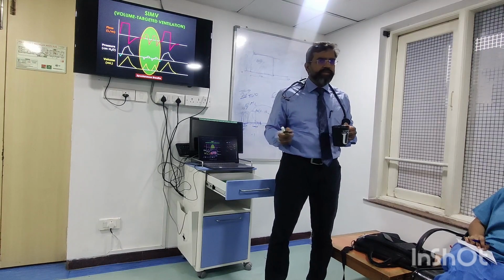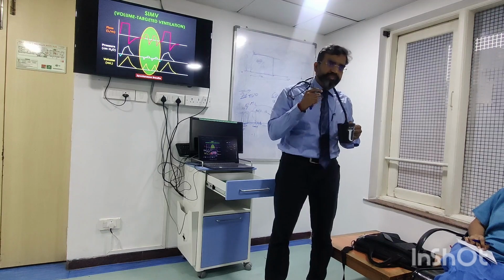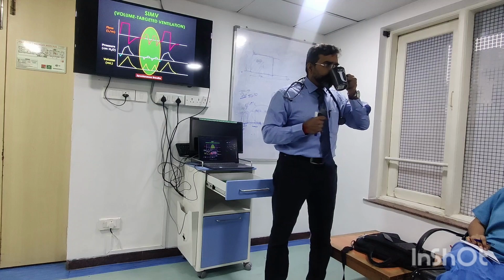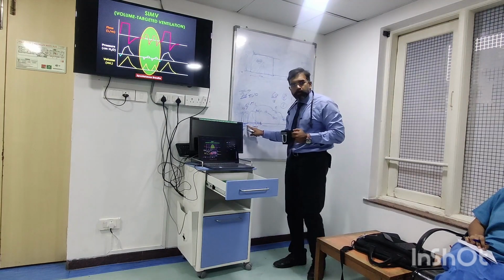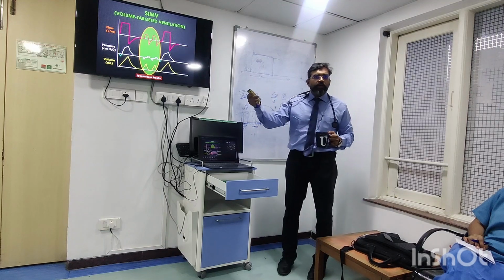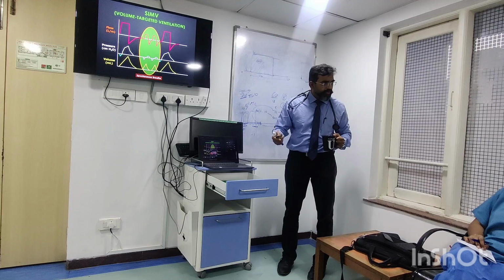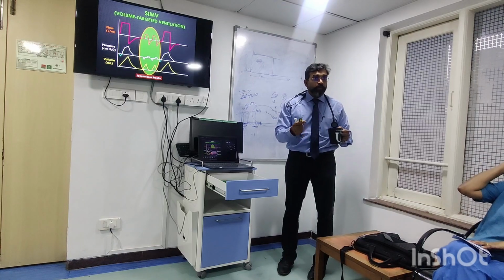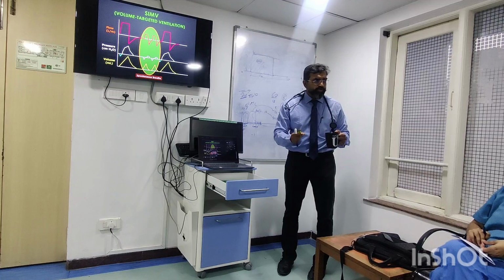If you look at the Servo 900 C, we used to work with the Servo 300 and 900s. For Servo 300 and 900, we had to set the SIMV period ourselves. When we were doing our ventilation, we had to set this period also, which you are not doing because of the high profile microsensor chips and solenoid valves that you are having. You are not doing it. It's done on its own. We had to set that because it was all mechanical. It was not computer based. So we had to set that in a certain way.